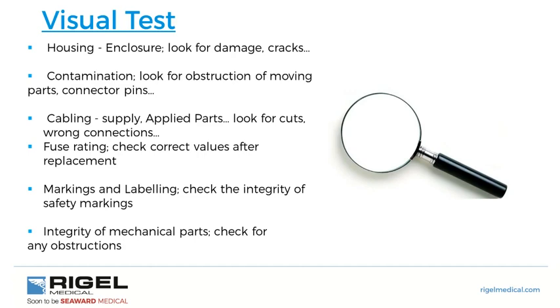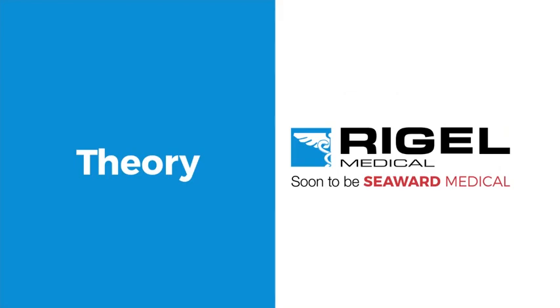Is the fuse rating correct? Check the correct values, and if a replacement is required, then replace that. Is the marking and labelling correct on the patient monitor? And the integrity of mechanical parts, check for any obstructions.